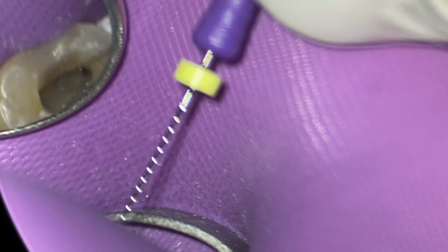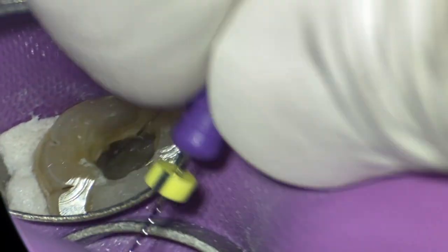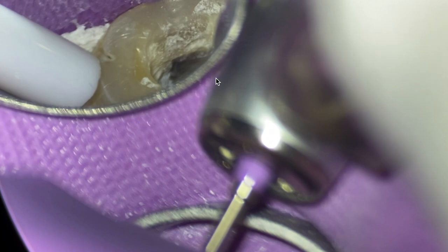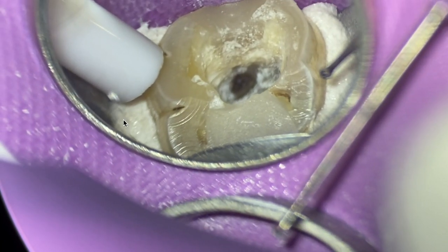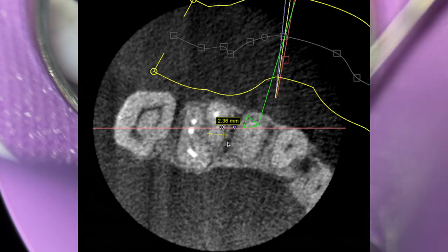I'm trying to use this file with a little bend to try to get into where that little white dot was, but I got a no-go. So I'm kind of like, hmm. Try, struggle, same thing. I'm trying all types of little angles and little bends. A lot of it's by tactile sense because it's hard to get a mirror in there and your scope at the same time. So I'm like, okay, maybe an eight isn't stiff enough. Let's try a number 10 C plus file. Again, active tip. I'm just trying to weasel it in there. Normally I'll use cotton forceps, but at this point I'm just trying to use just my fingers to get a little bit more pressure in there.